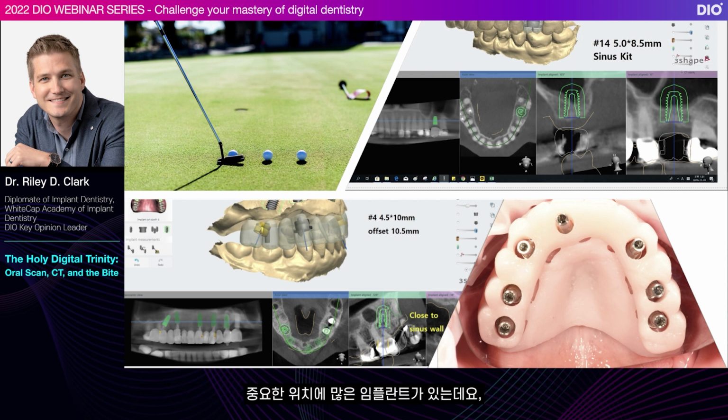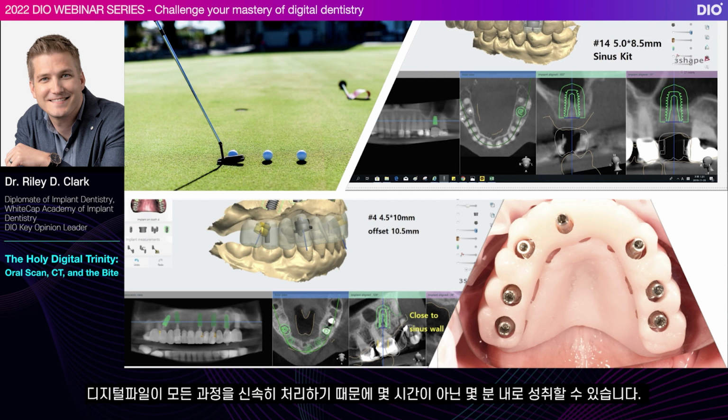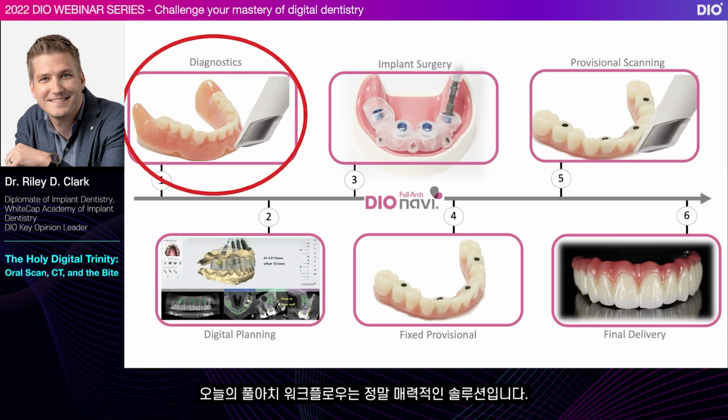We have multiple implants in key positions. They are all parallel to each other, and they fit beautifully relative to a prosthetic. That picture on the bottom right is why the data is so important and how powerful it is, because we can accomplish things like this in a matter of minutes instead of hours, because the digital files allow us to expedite this entire process. So again, I'm going to start where I end.